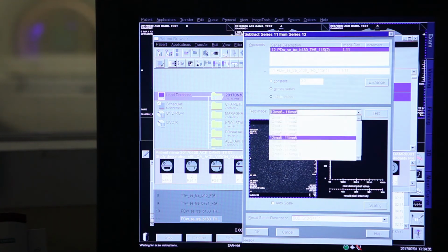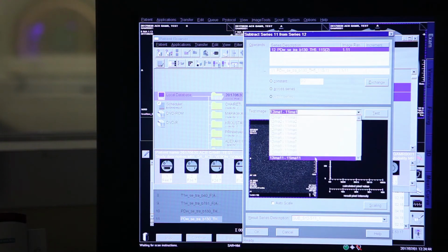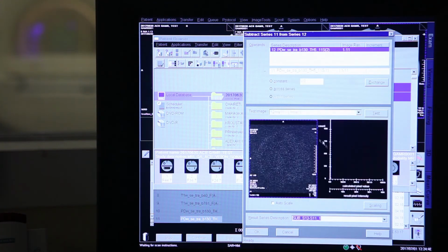Let's move to the other slices. Go to the edge of the image, for example, and see what's going on. You see some distortions at the edge, as there should be. You take the one edge and the other edge. I'm satisfied with the image. So you have something which is nothing, but it's not really nothing, because in MRI, nothing is not nothing. Even air can have signal there. You shouldn't expect a flat image. Otherwise, there's a ghost. There's a small ghost here.